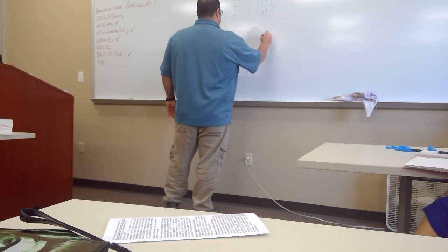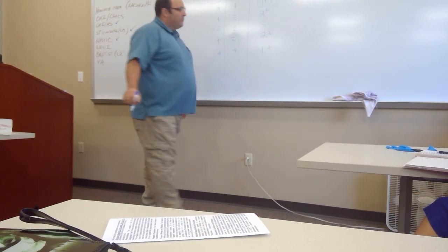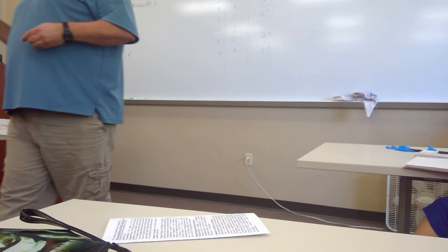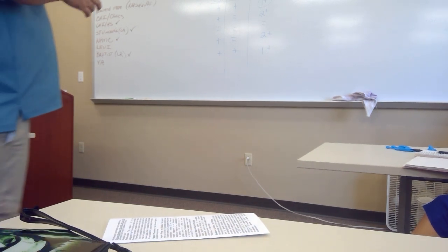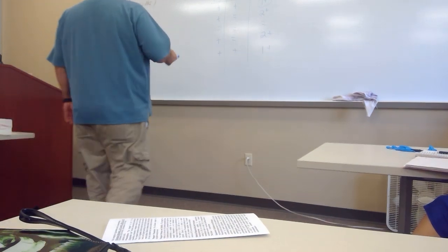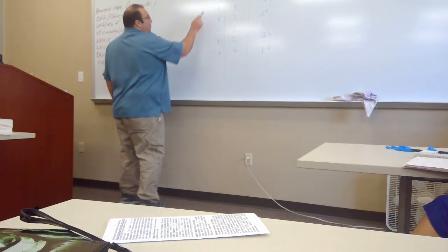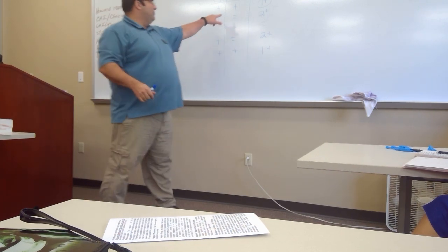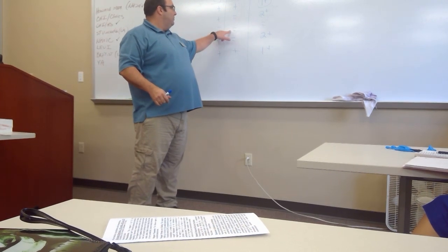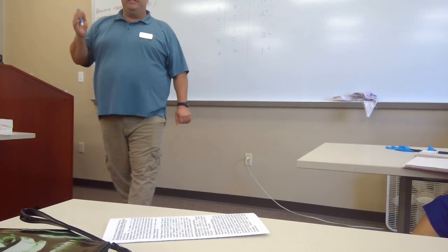One of the things I told you: when you start getting multiple different strengths of reactions, the first thing you start thinking is multiple antibodies present. You got all these 1s and 2s, so you start thinking, is there 2 antibodies there? No, there's not. There's still just 1. It's just showing dosage, because of the codominance. And that's why it tends to cause problems.